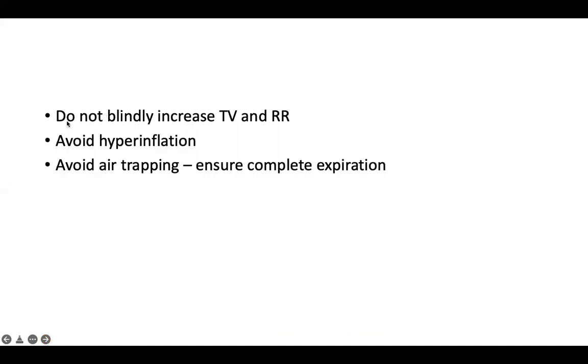So what did we learn? Do not blindly increase tidal volume and respiratory rate. Always avoid hyperinflation. Whenever you are increasing the respiratory rate, initially we said ensure that inspiration is complete. Similarly, ensure that expiration is also complete. We cannot blindly increase respiratory rate.